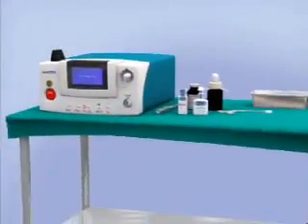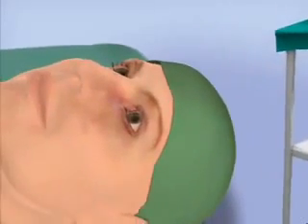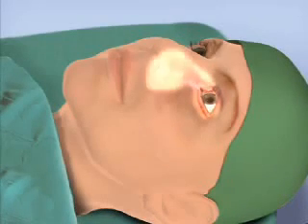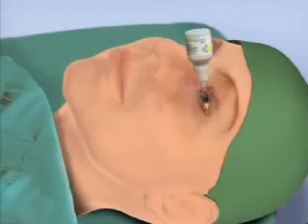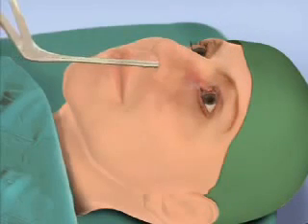Because of the reduction in operating time afforded by the laser, dacryocysto-rhinostomy can be performed with topical anesthetics applied to the eye surface, excretory lacrimal duct, and nasal cavity. Local regional injections are not needed, and this contributes greatly to alleviating the patient's anxiety and reducing intraoperative risk and postoperative sequelae.